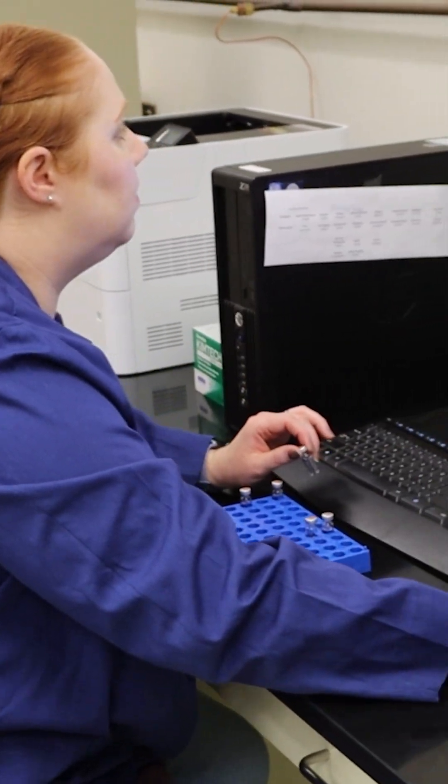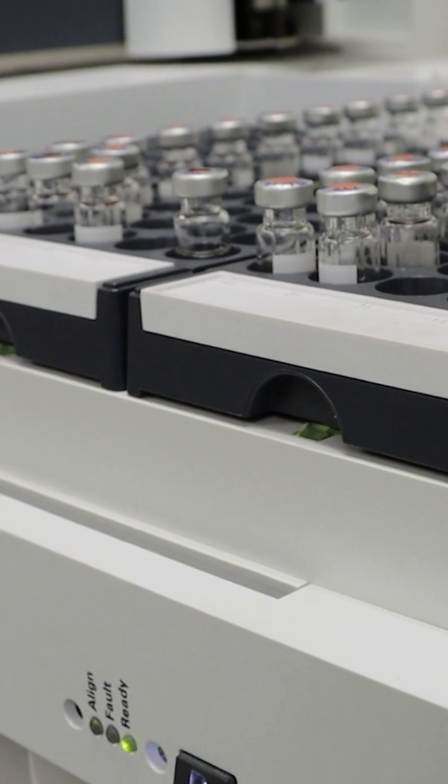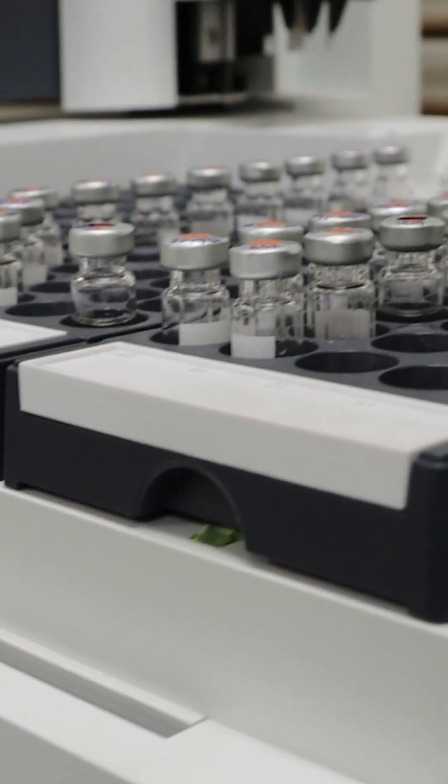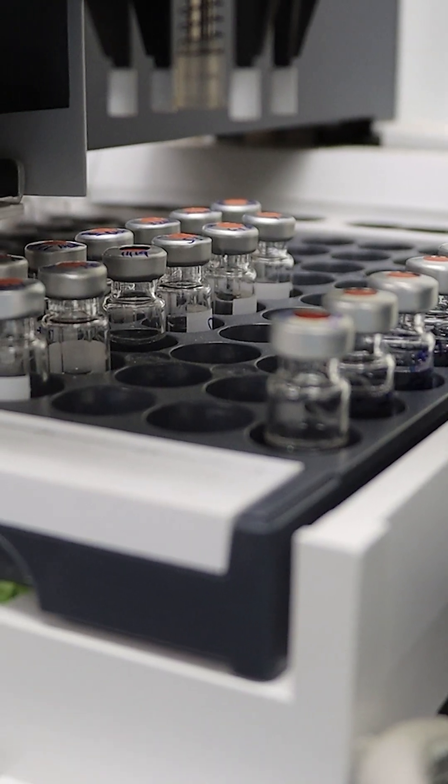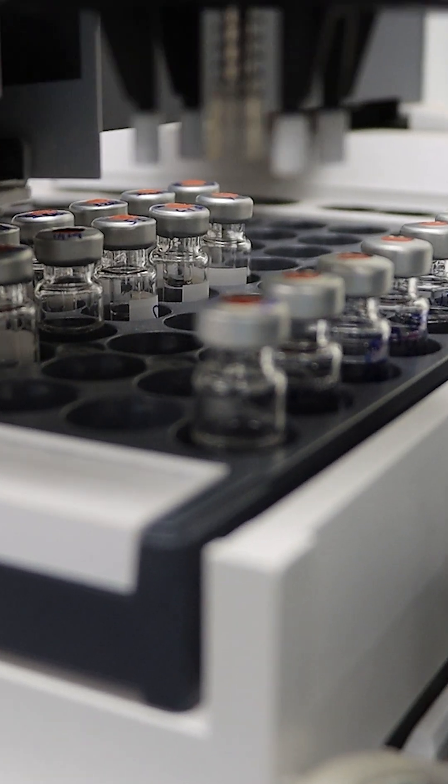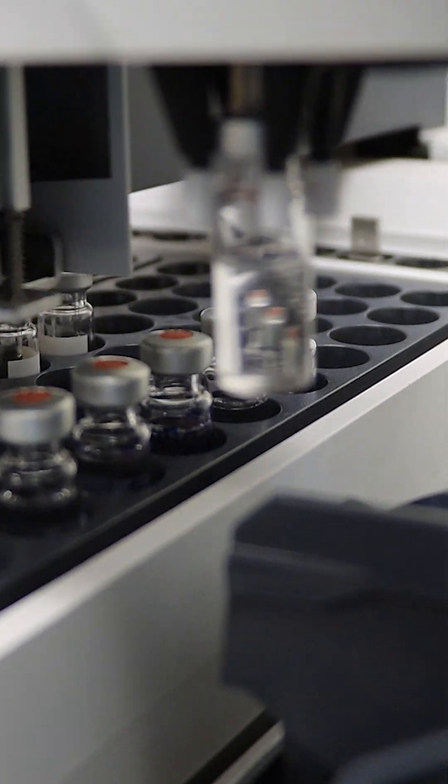We use a gas chromatograph mass spectrometer for our analysis, abbreviated to GC-MS. It's a two-part instrument with the GC portion, the gas chromatograph portion, separating compounds based on their polarity and their interaction with the column as it pushes them through.